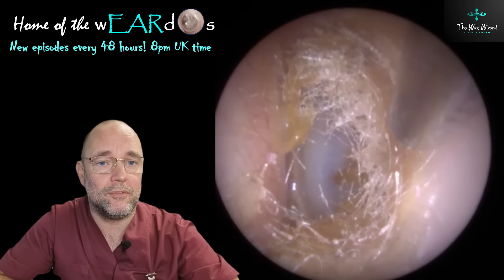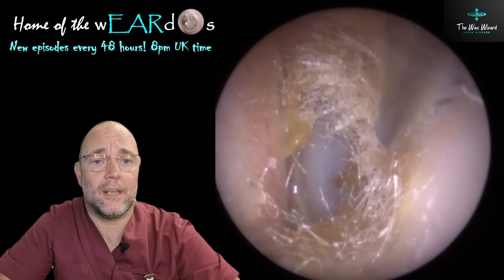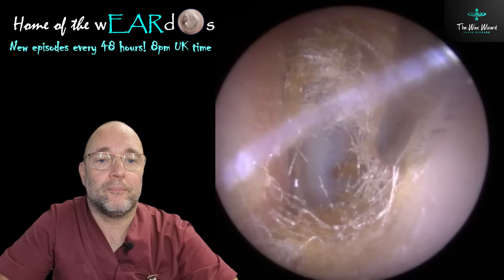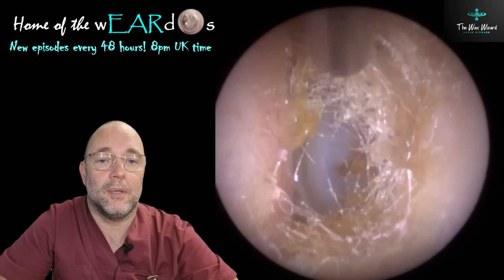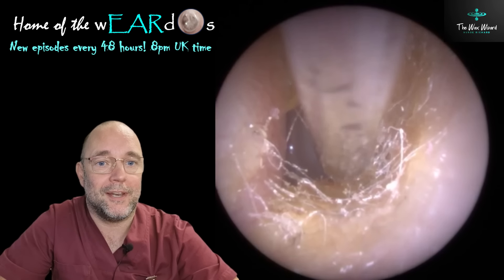You have to think of how much room you've got when you're thinking about using tools. Because we do get asked in the comments quite a lot — why do you use this tool for that, why do you use that tool for that? Most of the time I don't even bother replying. I just say because I know what I'm doing and I know how to get it out.